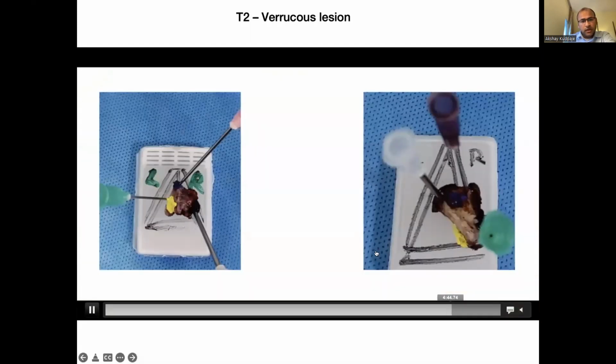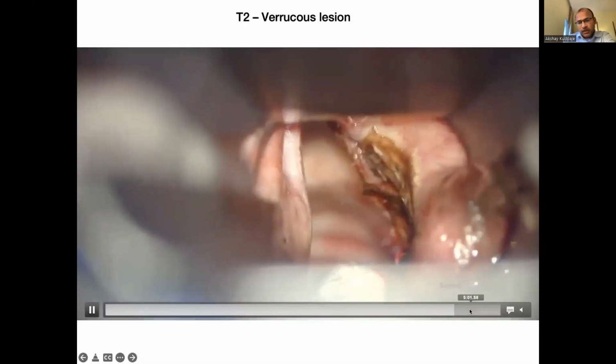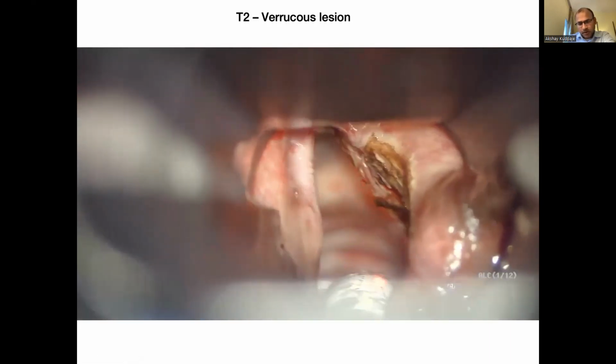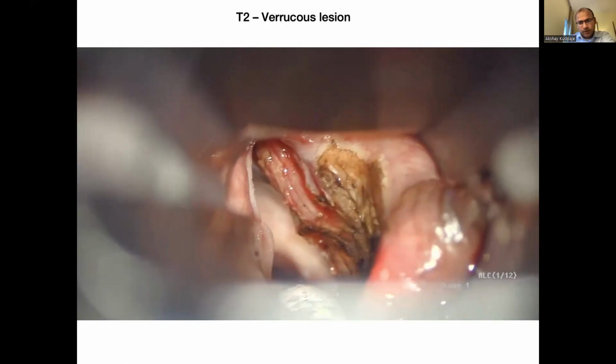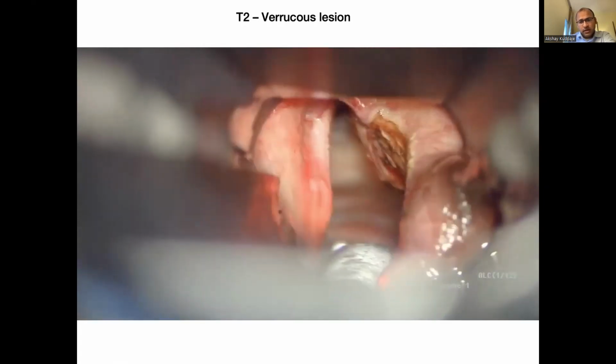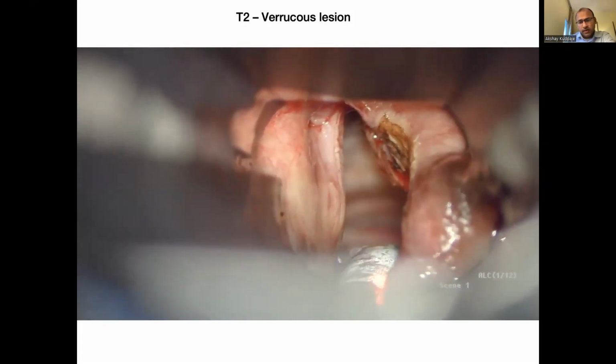So again, orientation with inking and proper pinning of those specimens and orienting this for proper analysis, and removing those carbon particles for better healing.